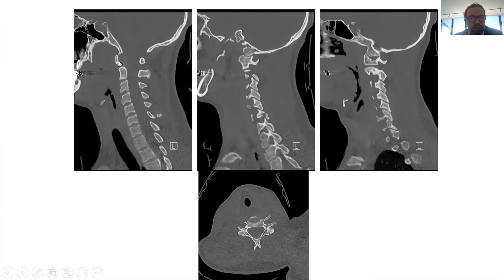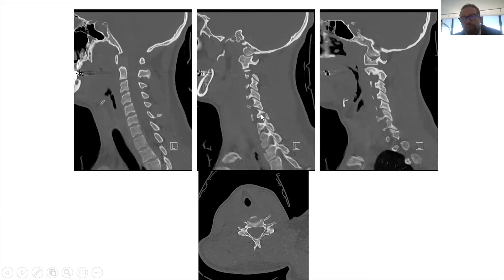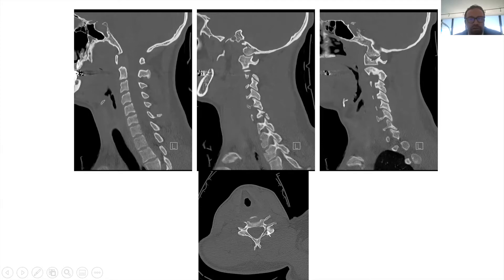You can see here the sagittal CT, and these are parasagittal cuts — cuts on both sides. You can see the vertebrae articulating with each other at what we call the facets or lateral masses. These are the joints. You can see there's a fracture through one of these facets — we call this a unilateral non-displaced facet fracture. These axial images show that structure is fractured.